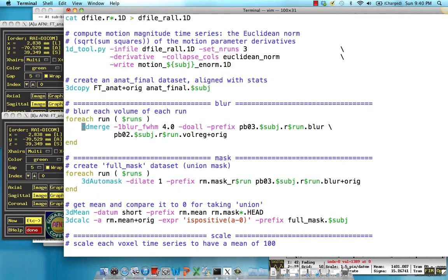Let's take a quick look at what this looks like in our script. The program is called 3D Merge. The option is blur underscore full width half max 4.0 — that's in millimeters. And 'do all' refers to doing this operation to all the sub-bricks in your dataset. It's a very simple command. That's all there is to the blurred part of the processing stream.